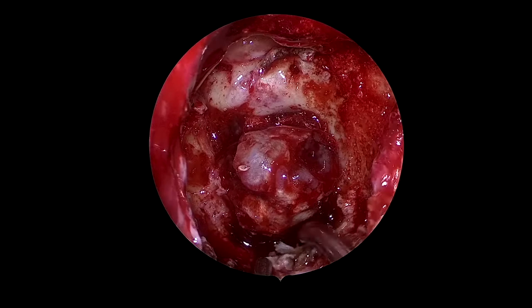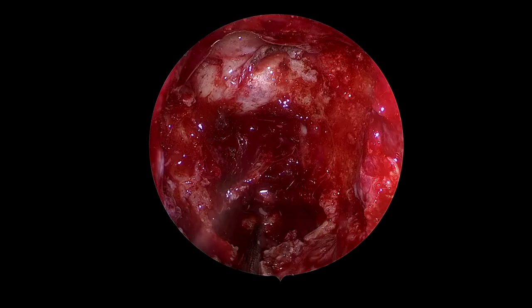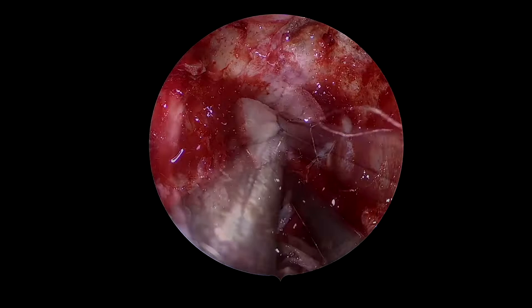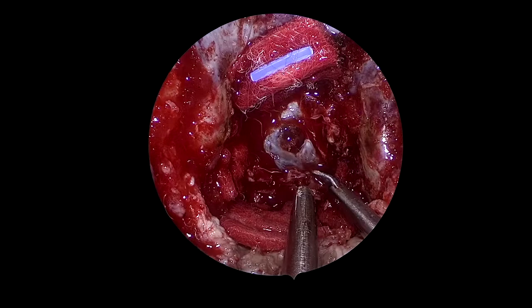Our goal, whenever possible, is to perform a supra-total tumor resection with clean margins. We are now all the way down to the level of the dura of the clival region. I'm going to make sure, before going intradural, that all the extradural tumor invasion has been removed, including the bone and the outer layer of dura, as you can see here being removed.